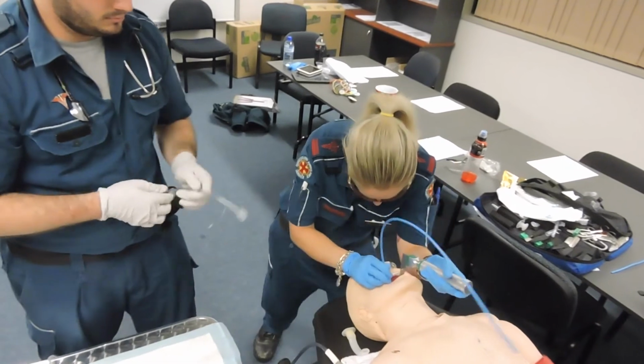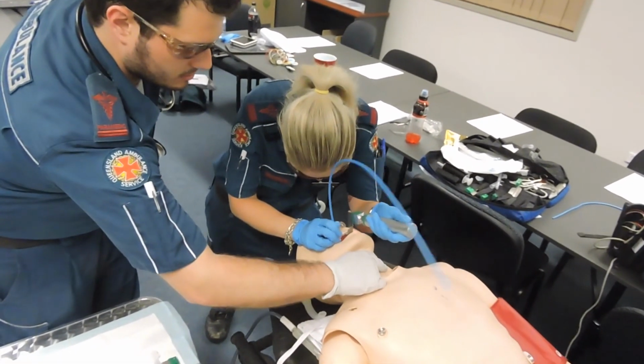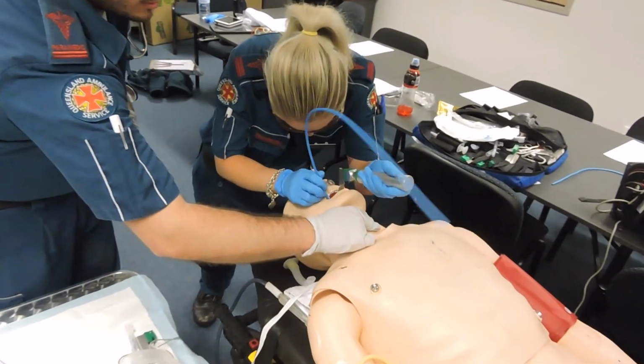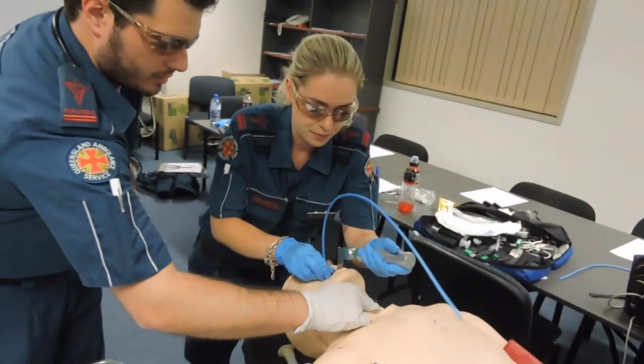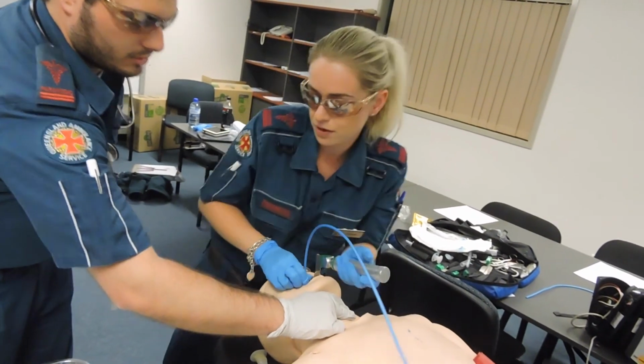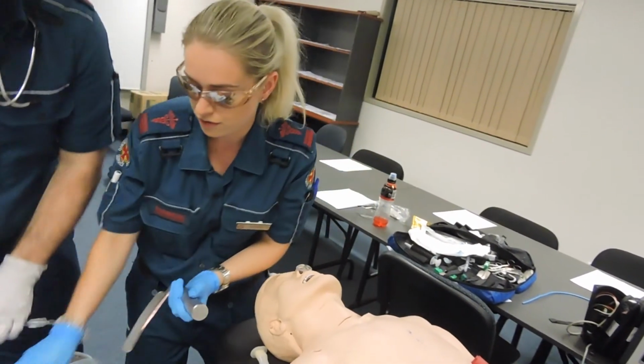Can you do BURP for me please, Ben? Yes. Alright, I'm not getting a very good view here. I think that was the problem before. Alright. What grade view? At the moment a grade 3, Ben. Alright, yeah. So what we're going to do, we're actually going to pull that out. I don't have a very good view.